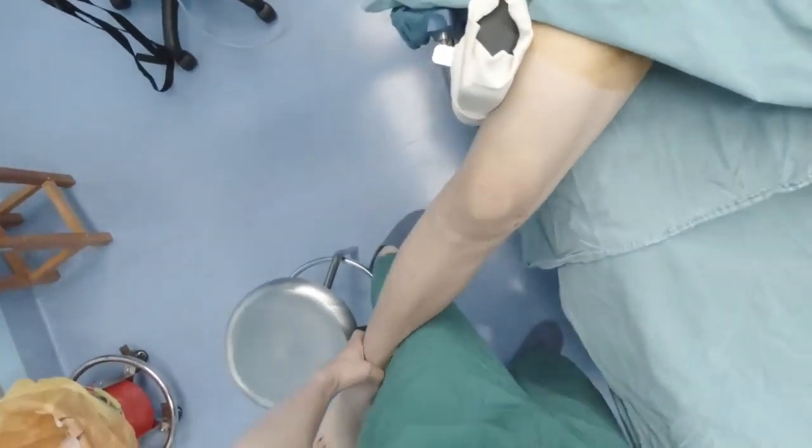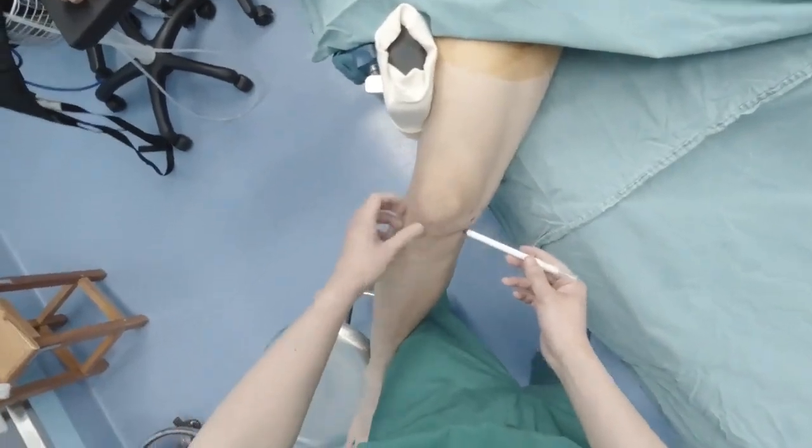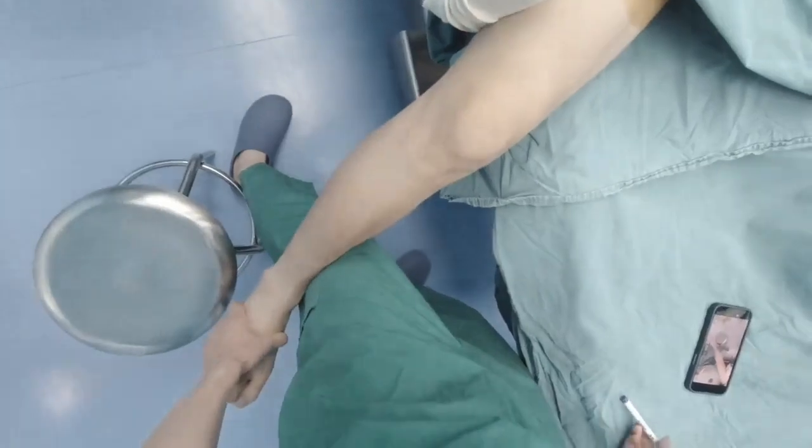Without foot support, the surgeon needs to sacrifice comfort and exert additional expenditure of effort to maintain the patient's knee position.